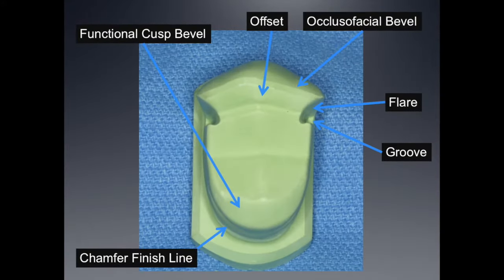When we look at it from the occlusal view, you can see the functional cusp bevel and chamfer finish line — very clear, understandable features of every crown preparation. But it's the flares, the offset, the small bevel, and the grooves that can sometimes make this preparation really challenging. So let's take a look at a video of a start-to-finish process of performing a three-quarter crown on tooth number four.